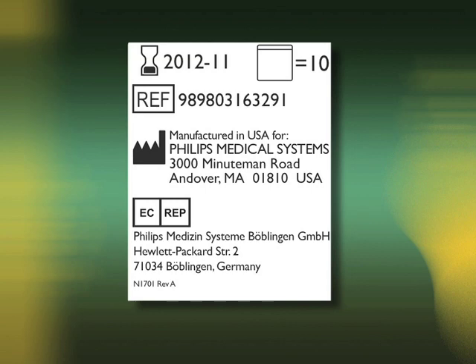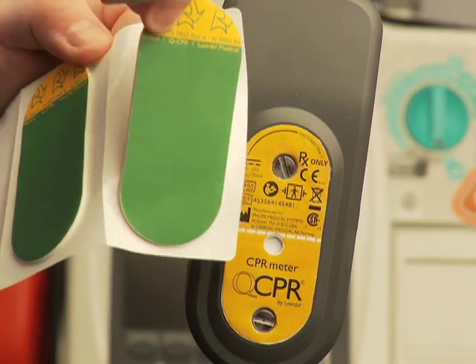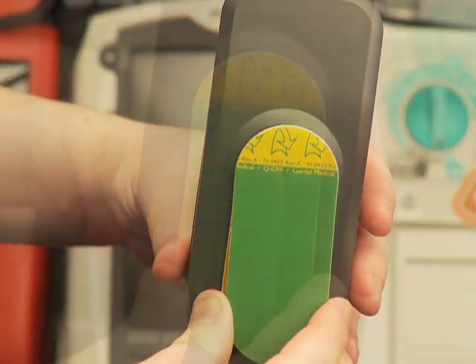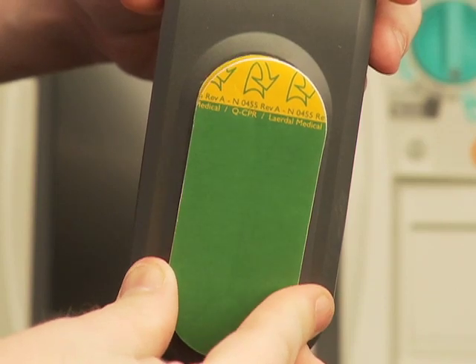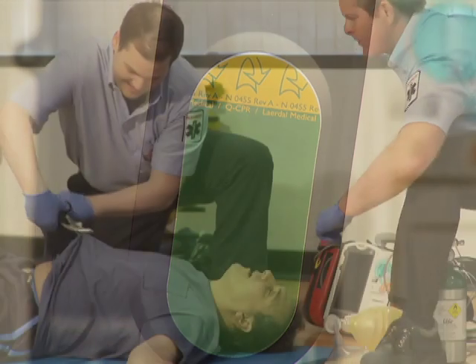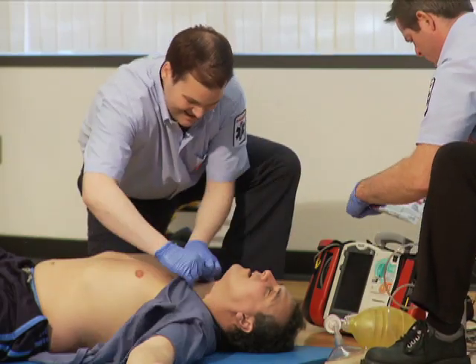Now check that the patient adhesives are within their labeled expiration date. Peel one from the white liner strip to expose the adhesive surface on its underside. Align the adhesive with the yellow area of the meter and press it into place. The green surface of the patient adhesive pad indicates that the sensor is prepared for CPR.